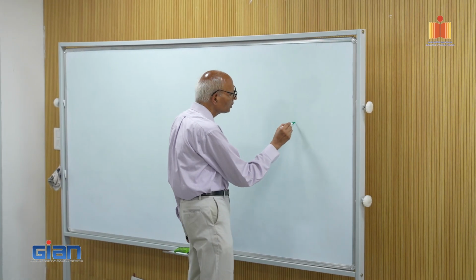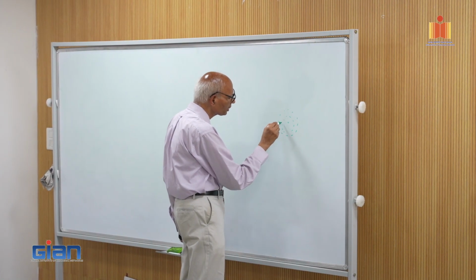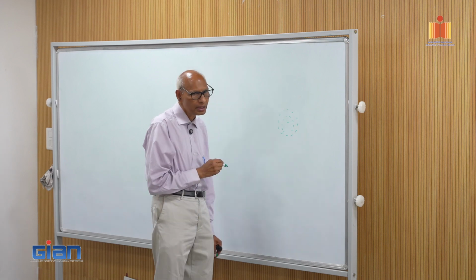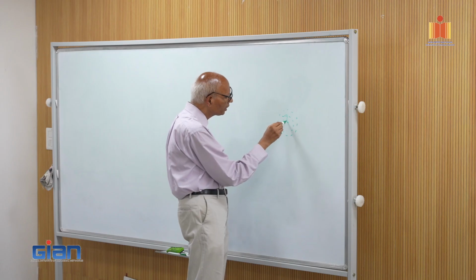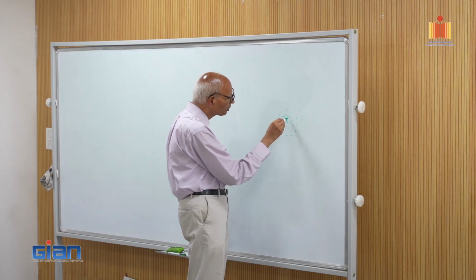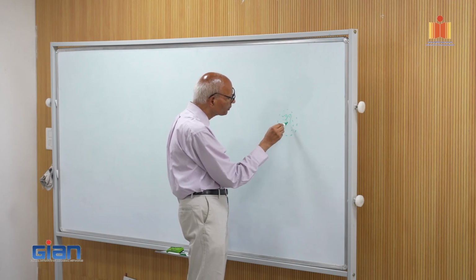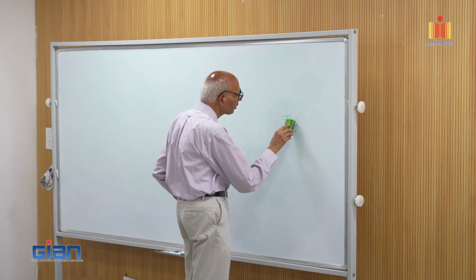Maybe I'll write it down here. Is this a good pen here? So suppose you have spots put all around like this. You are interested in the dose at this point. The dose at this point will come from the profile of this spot, which will contribute something. Suppose you have another spot here that will also contribute some dose.